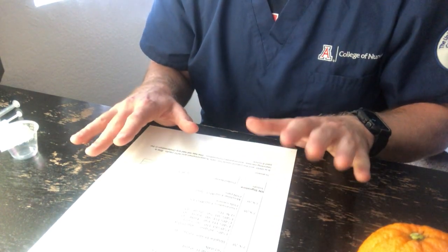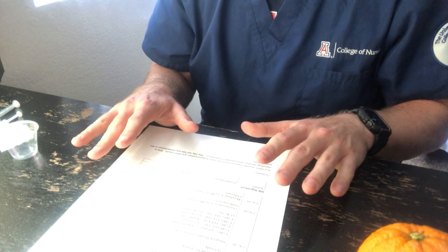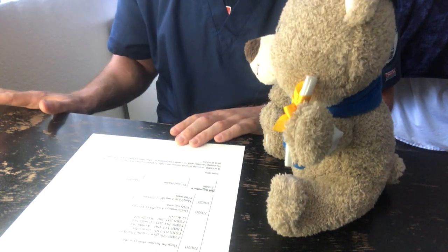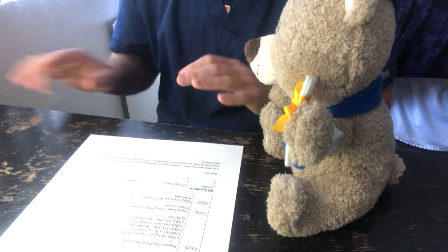I'm going to move to my third check, which is administering the medication. So this is my patient here. This is Marge Simpson. So I have my medications prepped. I have my water for my PO, and my sub-Q and my IM injections with me.